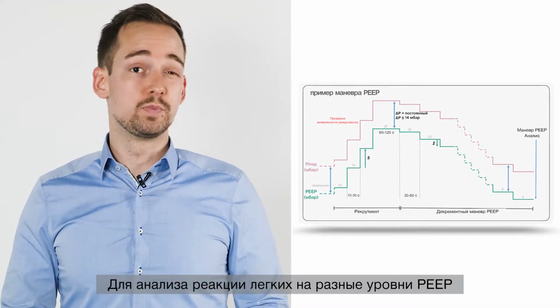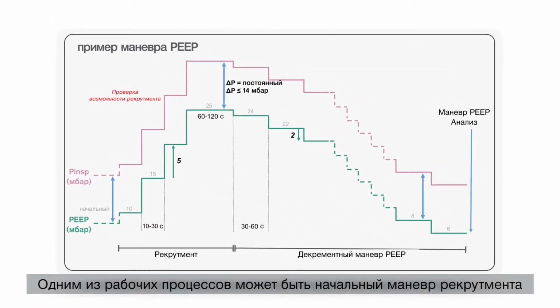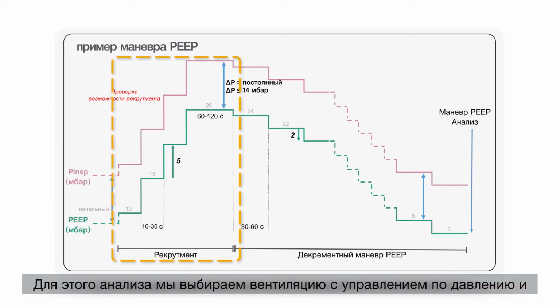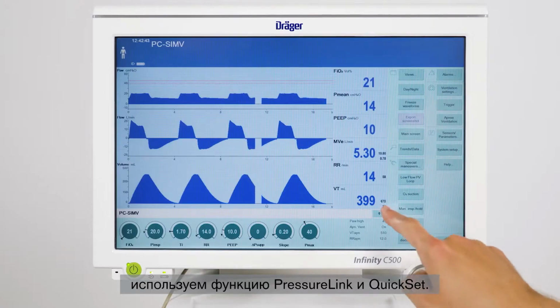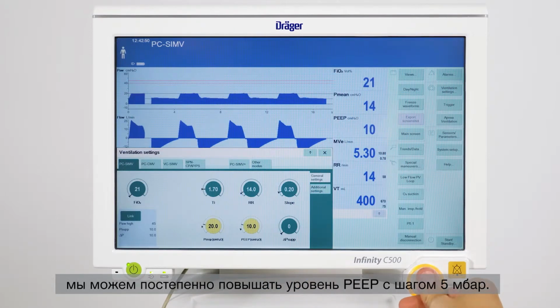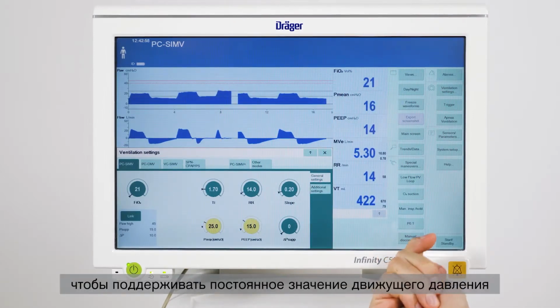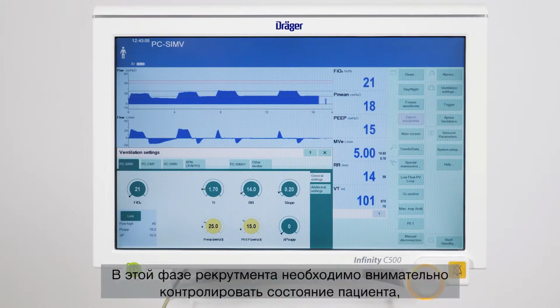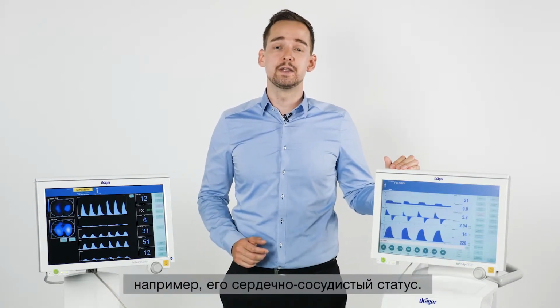In order to assess the lungs' response to different PEEP levels, we need to perform a PEEP trial. One possible workflow could be an initial recruitment maneuver followed by a decremental PEEP trial. For this analysis, we choose pressure-controlled ventilation and use the function pressure link and quickset. In order to gradually open the lung, we can stepwise increase the PEEP level in steps of 5 millibar. We can use pressure link and quickset to keep a constant driving pressure and apply the increased PEEP levels immediately. During this recruitment phase, we have to closely monitor the patient's condition, for instance, the patient's cardiovascular status.